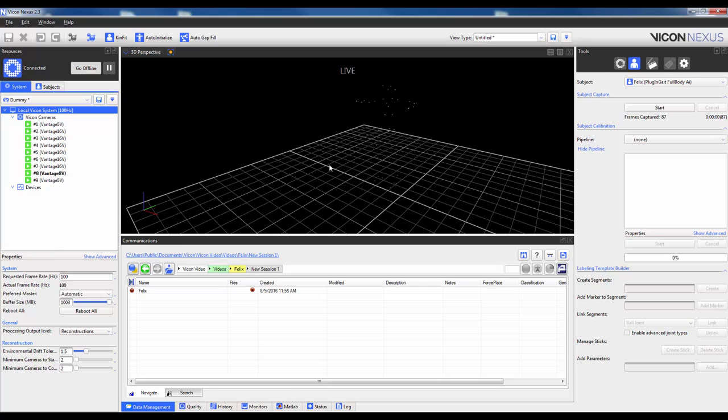Then when you're confident all the markers are there, go ahead and click Start. The subject will need to remain as stationary as possible during capture. You only really need one frame of acceptable data, so I will make this about one second long.